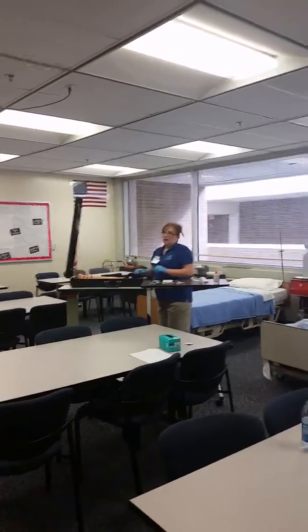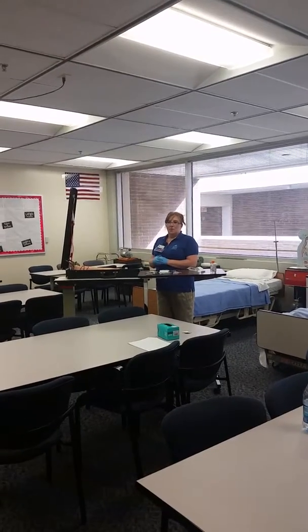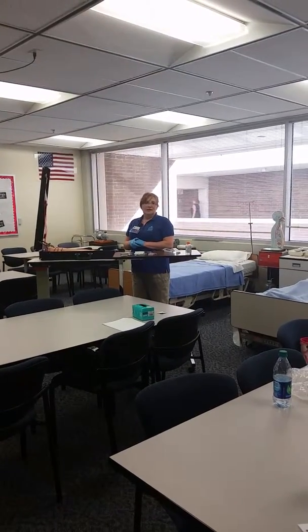Okay. And then when the procedure's over, I'm going to document time and date, that we put it in the right forearm, the size of the catheter and the needle. I got it on the first attempt, how the patient tolerated it, and any instructions.